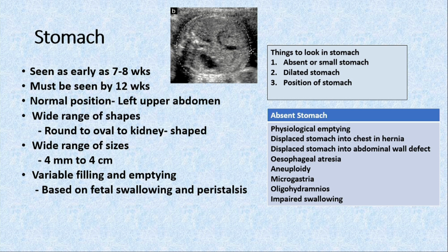What are we going to do? Whenever we see a very small stomach, we ask the patient to wait for half an hour, 2 hours. Maybe you evaluate again. If it is filled, well and good. If it is not filled, evaluate again after 4-6 hours. Again call the patient next day. And in spite of that, if you are not visualizing, call the patient again after 2 weeks. This is the protocol for absent stomach and a small stomach.